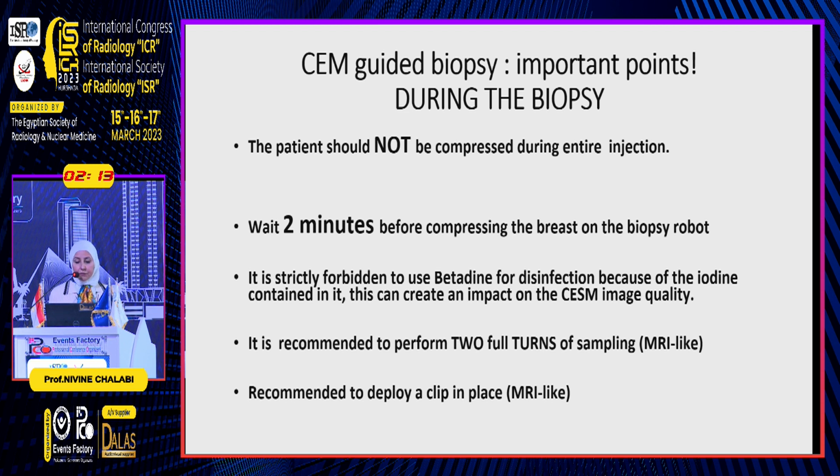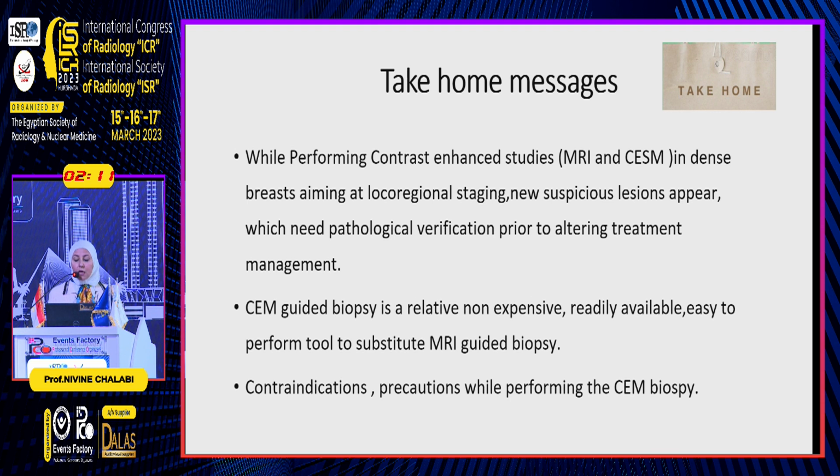So my take-home message is that while performing contrast-enhanced studies like MRI and contrast-enhanced mammography in dense breasts, aiming at loco-regional staging, new suspicious lesions appear which need pathological verification prior to altering treatment management. These lesions are sometimes occult on mammography and ultrasound.